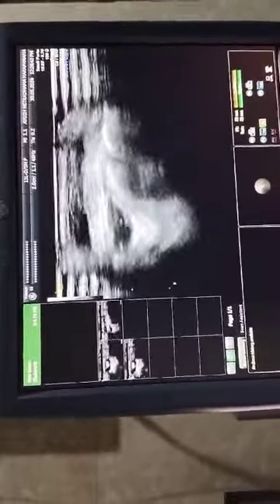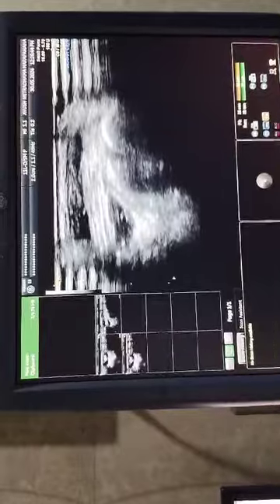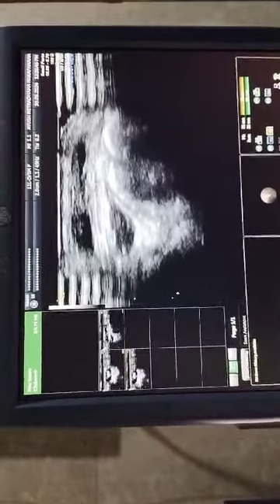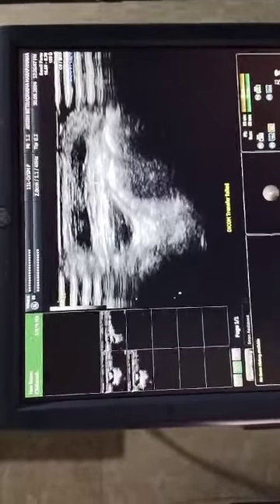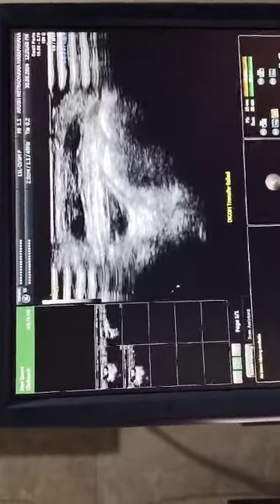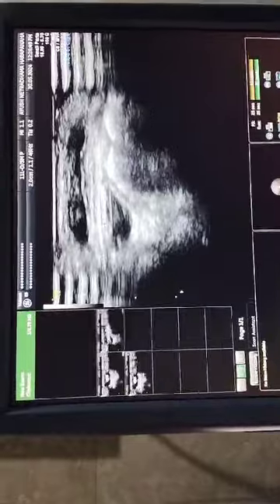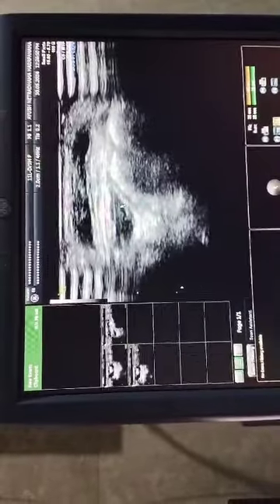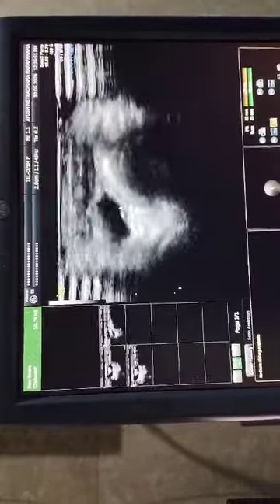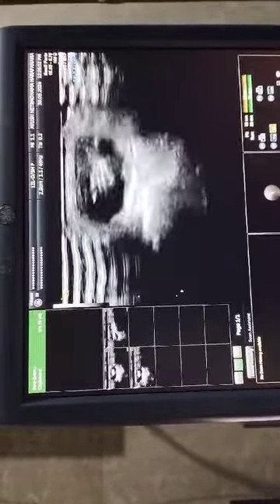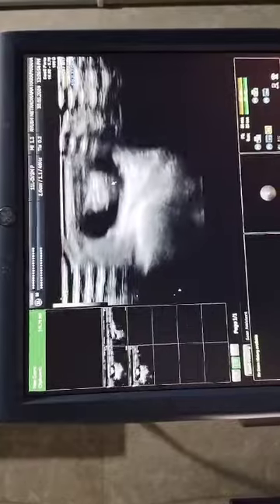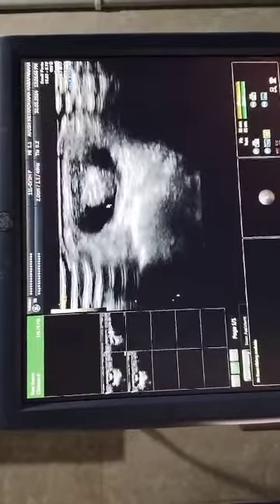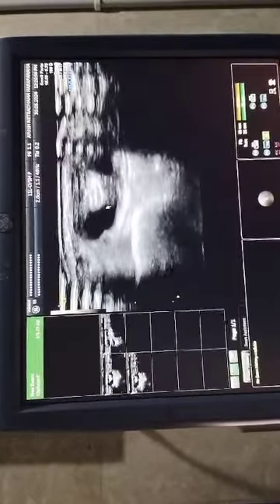This is the cranial-caudal extent. You can see the tendon and the fluid surrounding it. When we look in the axial plane, we can see fluid surrounding the tendon.